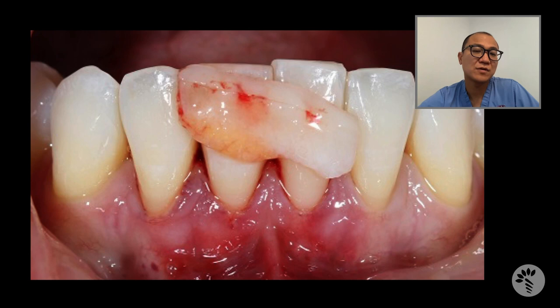First, I took a connective tissue graft from the palate. On the recipient area, instead of opening a flap like in standard connective tissue grafting, I created a tunnel on tooth numbers 24 and 25 — 41 and 31. And you can clearly see that I intentionally left epithelium on the connective tissue graft.